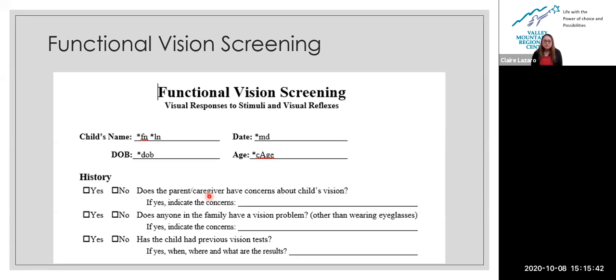And so for this one, I'm going to be showing you all these white aspects. It's like a cutout of the paper of the actual vision screen. So I made it this way so that it makes you familiar with what it will look like. We made it in such a way that the first part would be the history.